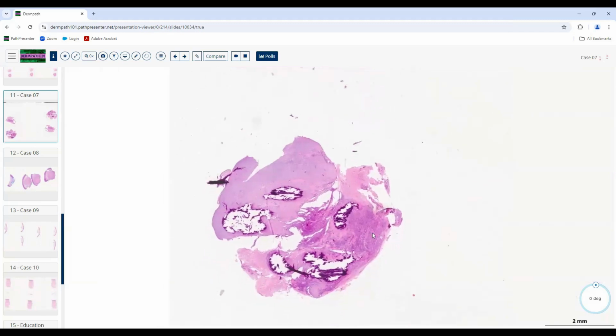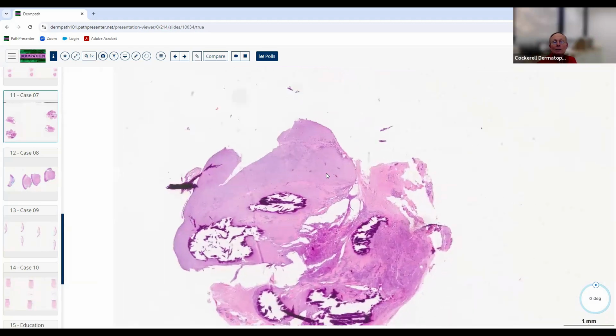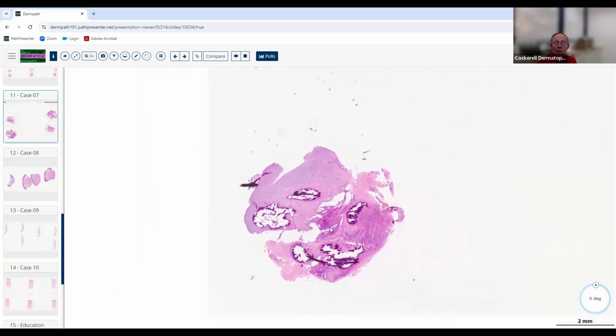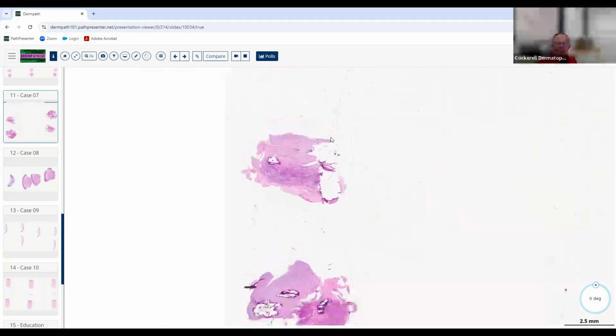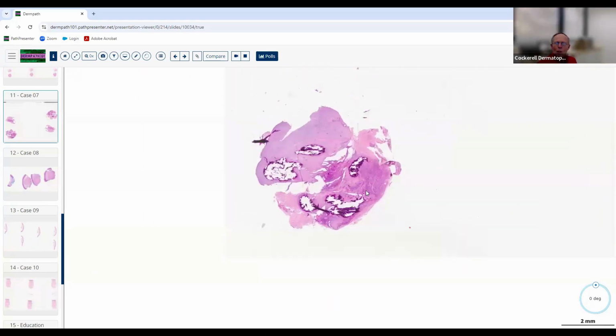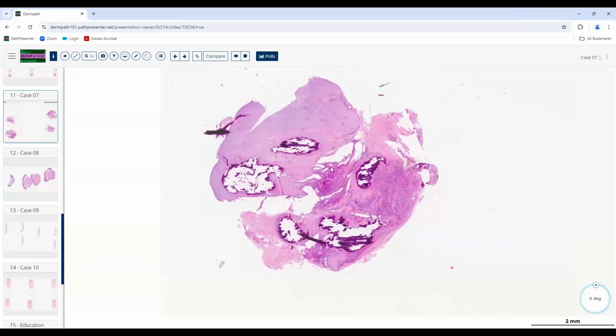Because the overlying epidermis, like that case of the pilomatricoma, had nice normal skin overlying it, or the mucinous carcinoma had normal skin overlying it. Here we've just got something kind of deep. So this is more like the schwannoma a little bit, right? They might have said, there's something deep to the skin here, let's go ahead and cut this thing out of here. So they basically enucleated it. And if it comes out like a little lump like this, does that favor benign or malignant? Favors benign. It does favor benign.